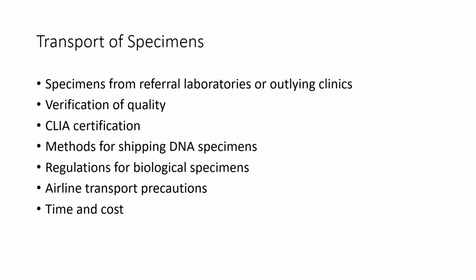There are specific guidelines that every clinical laboratory has to follow, and those guidelines are in place not only to make sure that we're doing things cost-effectively and timely, but also to make sure that when we get tubes to where they need to go and we analyze them on the analyzers that we do, that the results are going to still be valid at that time. We also want to make sure that these specimens are getting from point A to point B safely. So we want to make sure that they're not going to open and cause like bloodborne pathogen exposure or anything like that. So we follow these regulations and guidelines to prevent pre-analytical errors, errors in reporting results, but also for safety issues and time and cost issues.